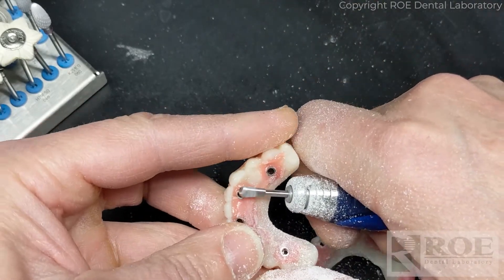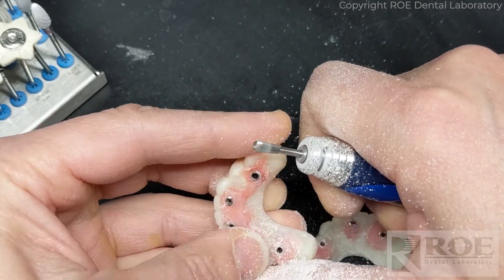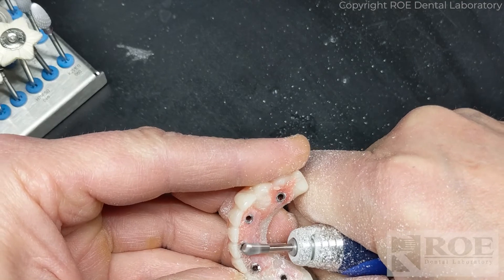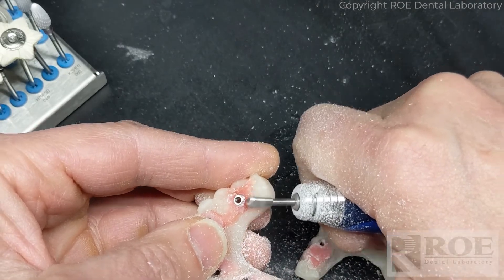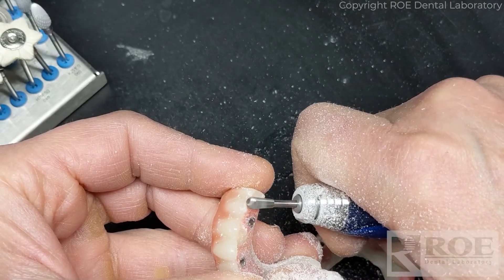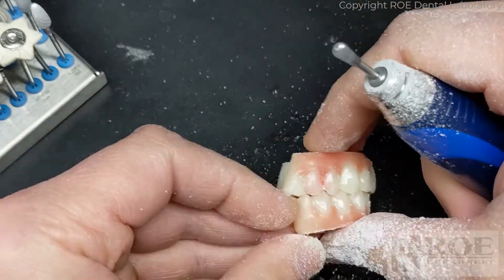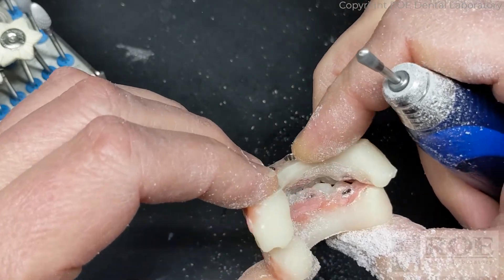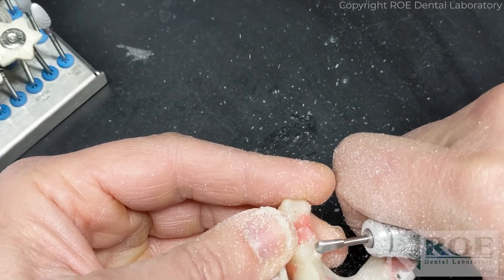Feel it with your fingers. There's a little bit of a bite issue because of our material - let's check that again. There's a little bit of a rock, and that rock is right here. So I'm going to adjust a little bit of this. You don't want to add any back in the mouth, so you're better off doing the adjustment in the mouth.